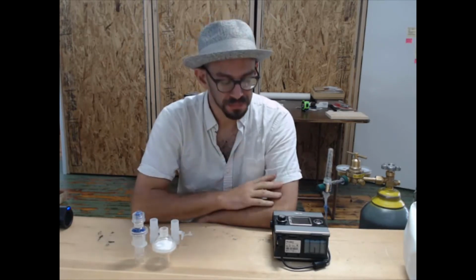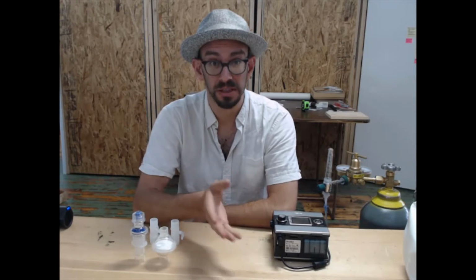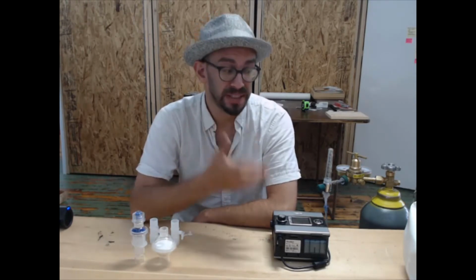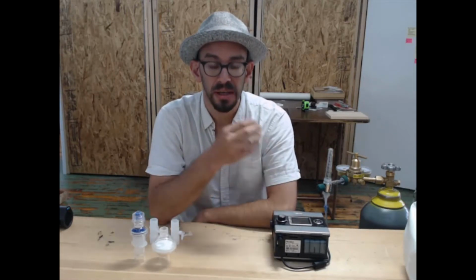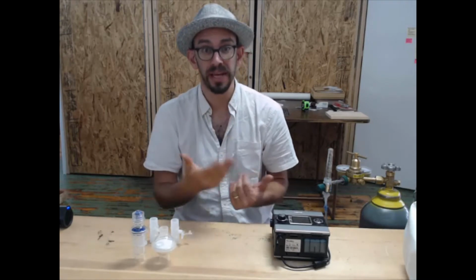And today, I want to walk you through what we're calling the Circum-Vent patient circuit and the principles of its operation, basic ways to set up your patient circuit, and the way to give a set of treatment parameters to a patient under your care.